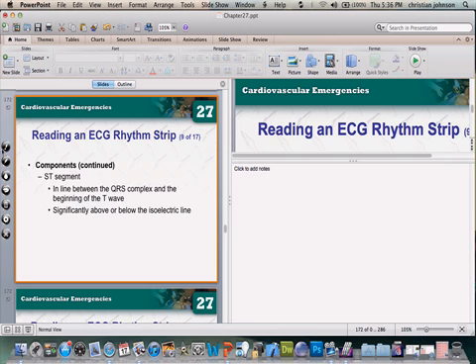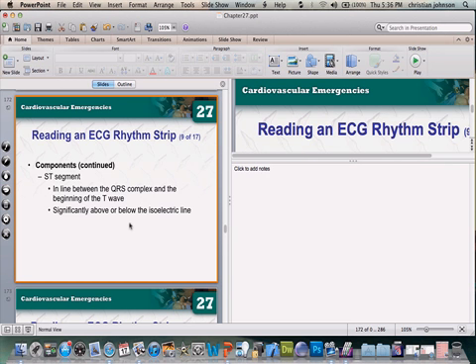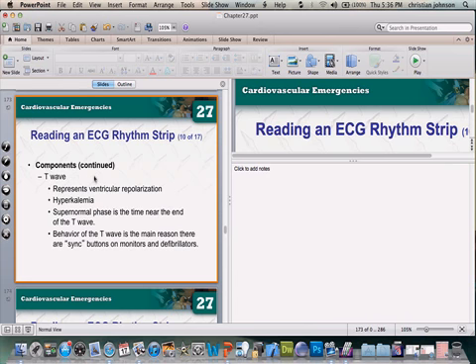Your ST segment, here's the EKG again. We have our P, Q, we have an R wave here, we have an S. Our ST segment would be, let's draw it elevated, the point where my J point started and where my T wave would start. That area is called my ST segment. Your ST segment should also be isoelectric. We use that to diagnose heart attacks as well. So when we're talking slightly above isoelectric or slightly below, that might be normal. But when we start talking about MIs and heart attacks, we'll get further into our ST segments.